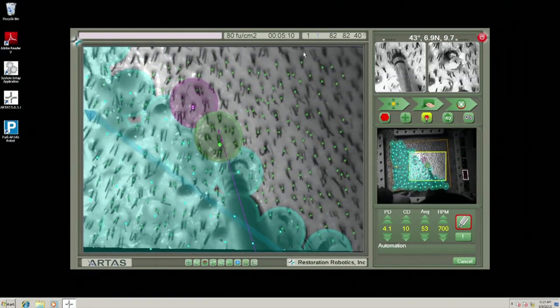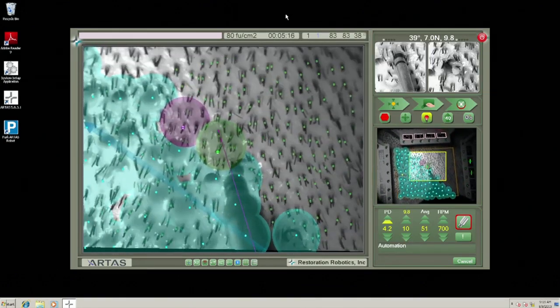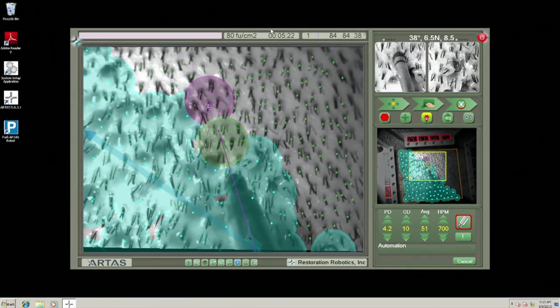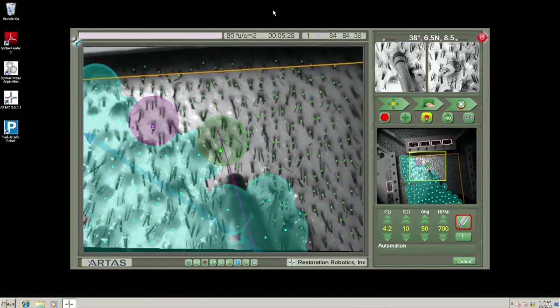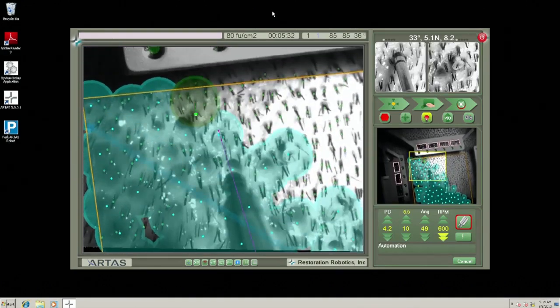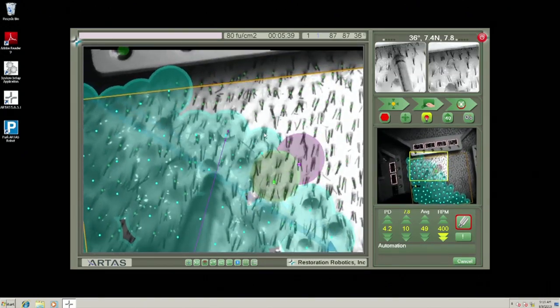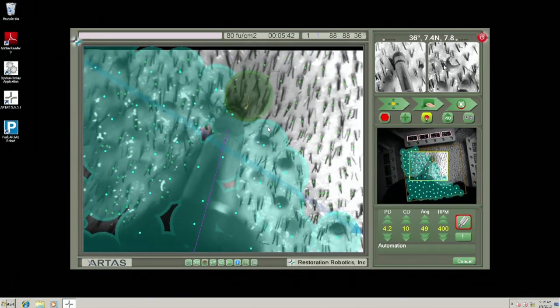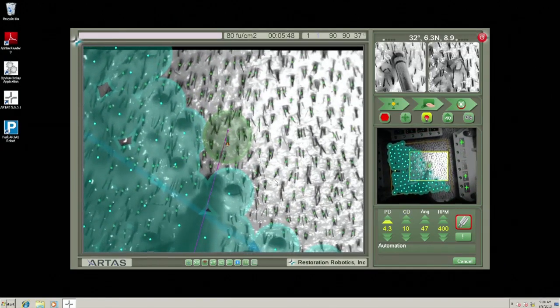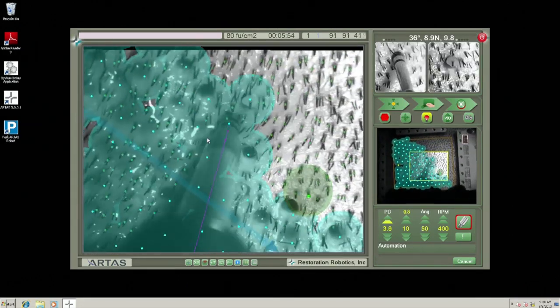Yes, correct. And so we were just talking about that when we started. The turquoise color clearly denotes that has been a previously harvested attempt, and it tells the robotic arm not to go back into that area. And so the green circles, which should be showing up as green, there's really only one large green circle. That's telling you where the robot plans to have its next dissection, and the purple circle that occasionally will flash in front of you shows you where we're going next. So it's kind of a prelude to what's going to happen in sequence.